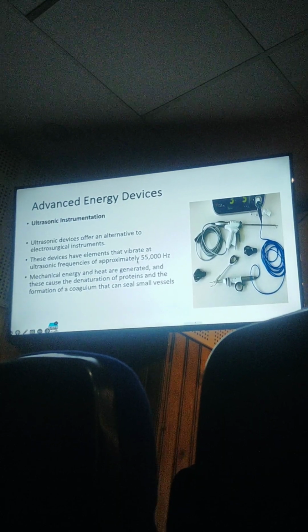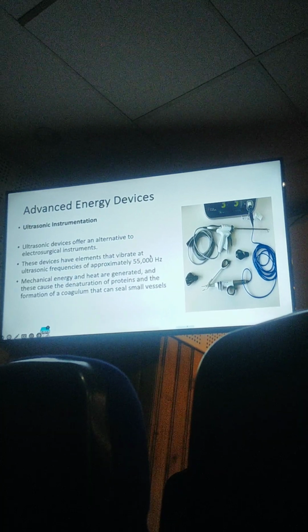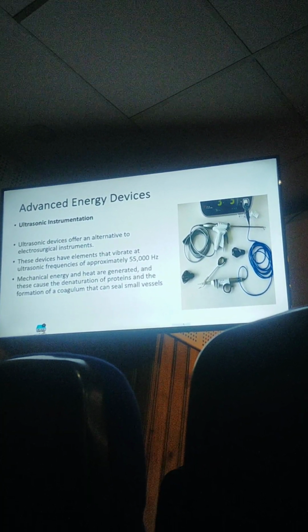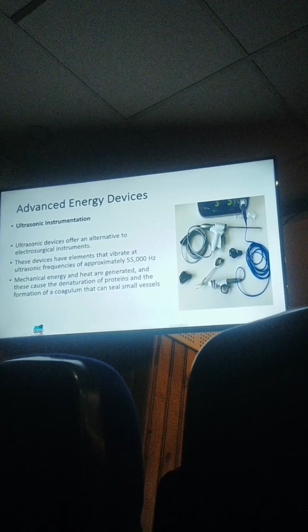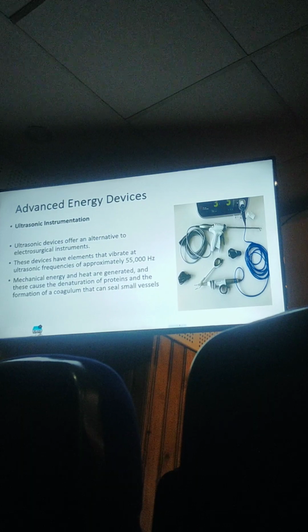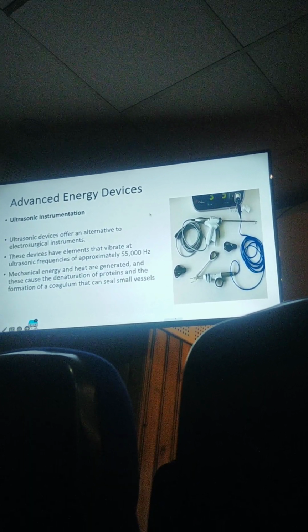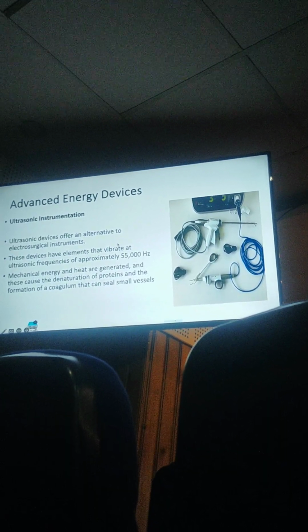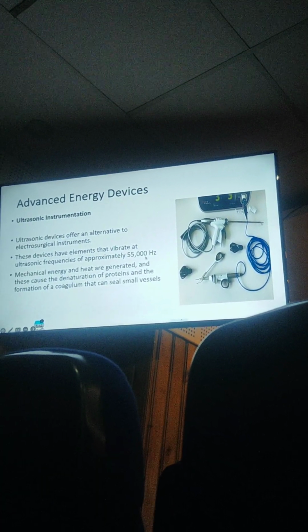at a frequency of 55,000 Hz, and that vibration will produce heat within the tissue that is grasped between its jaws, and that heat will have a desired effect, depending upon the temperature which is reached. So in this advanced energy device, the ultrasonic device, sound waves are used at a frequency of 55,000 Hz, but we don't hear the sound.